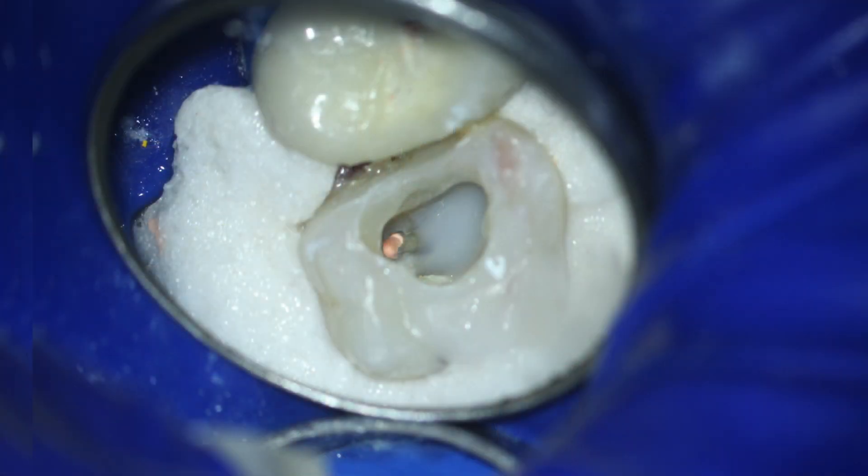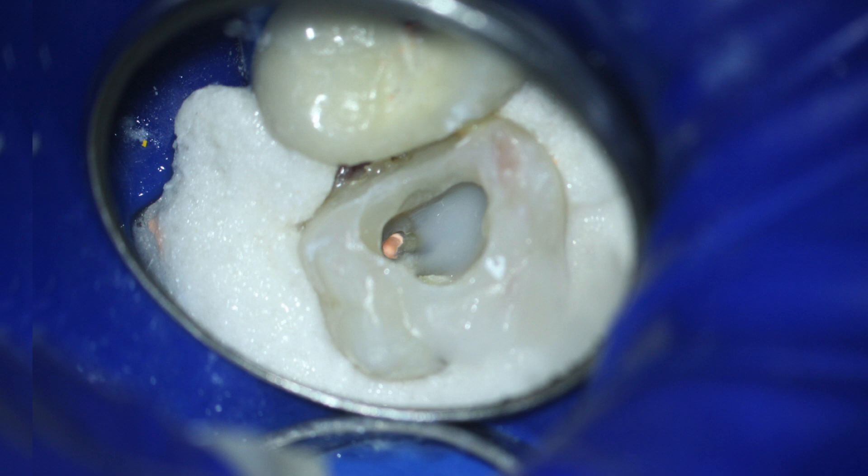Following completion of the treatment, I tend to prefer to place a final restoration. However, if my restorative dentist prefers that I do not, at very minimum I'm going to place an orifice barrier over the canals to protect that work. If my restorative dentist requests that I leave the option for a post, I'll refrain from having the orifice barrier flow over the palatal canal. The case is then provisionalized — I'll take a piece of endodontic sponge, apply it into the pulp chamber proper, put a little Cavit over the top to close this off, and send the patient back to the restorative dentist for the final restoration.